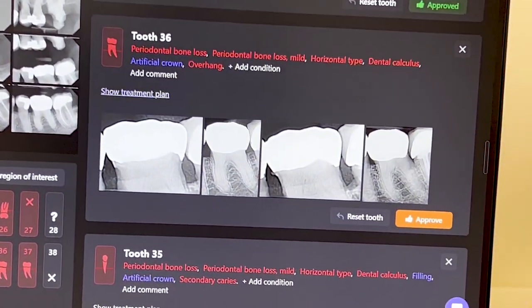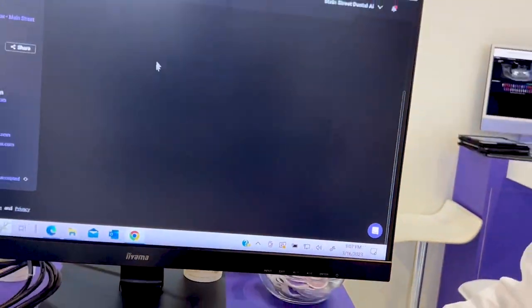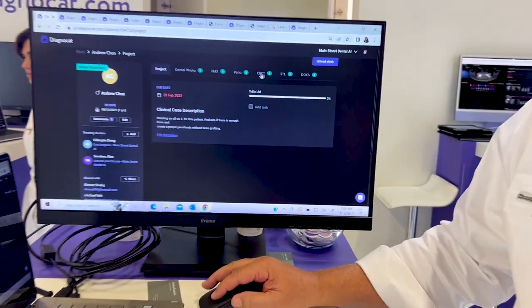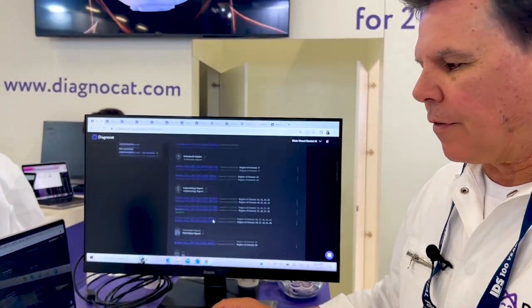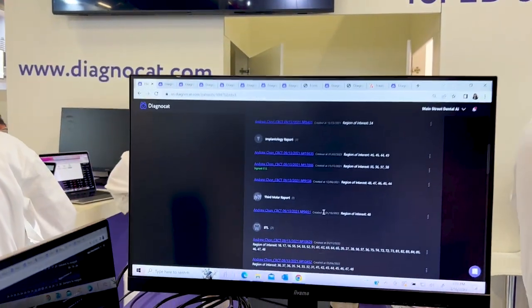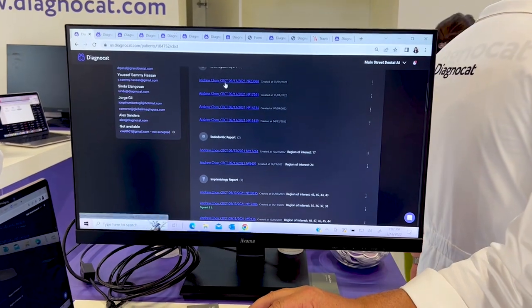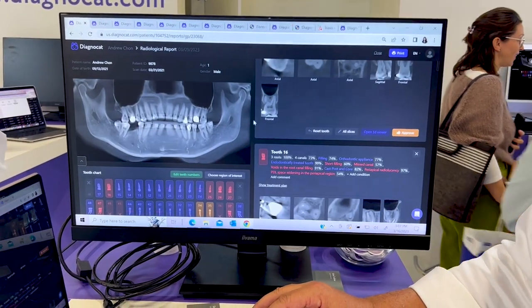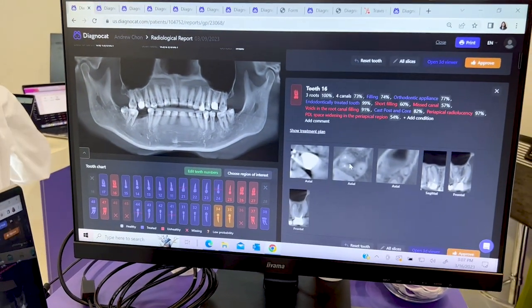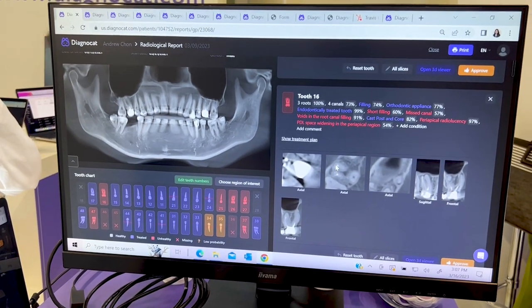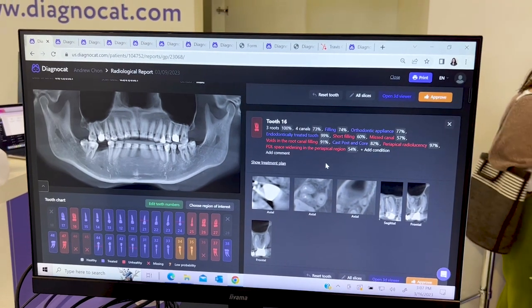We do 2D and 3D, so we can also do a CBCT. It'll find over 65 conditions on 3D. Let me show you a report — up comes the report just like the 2D, but you also have the slices so you can get a very detailed diagnosis by Diagnacat.